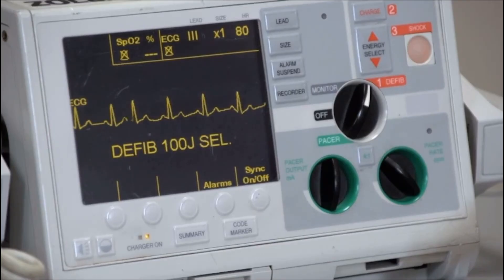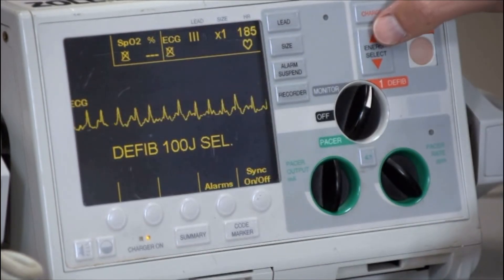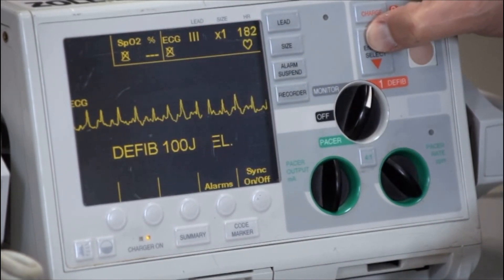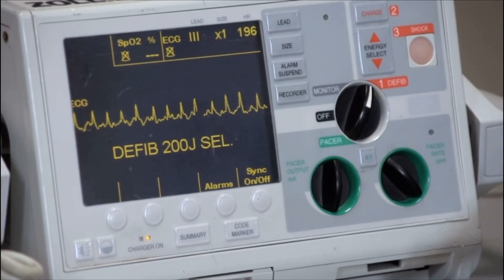Check the monitor to determine whether the patient is converted to sinus rhythm. If not, an additional shock may be given. For additional shocks, increase the energy delivered to 200 joules for a biphasic machine and 360 joules for a monophasic machine.